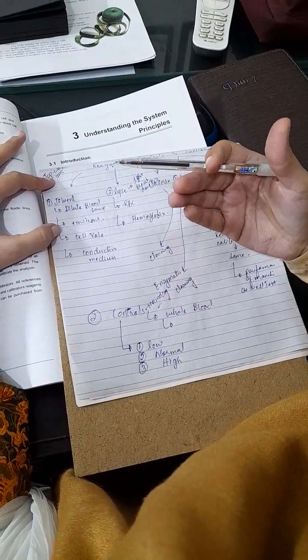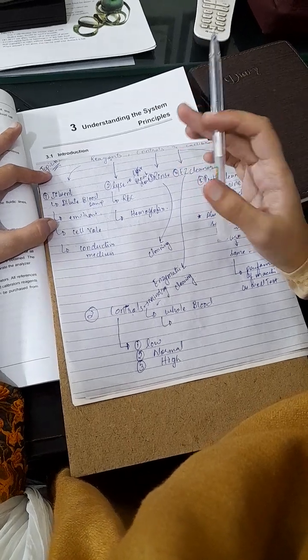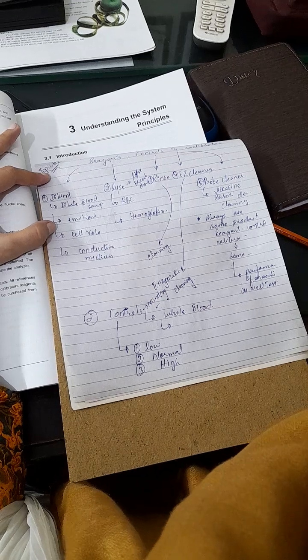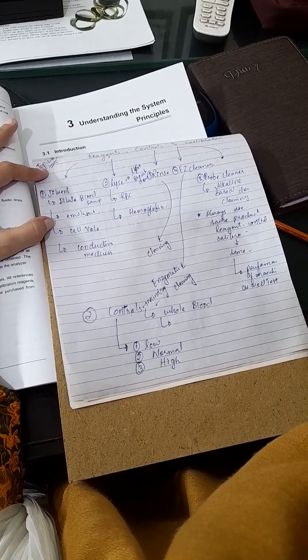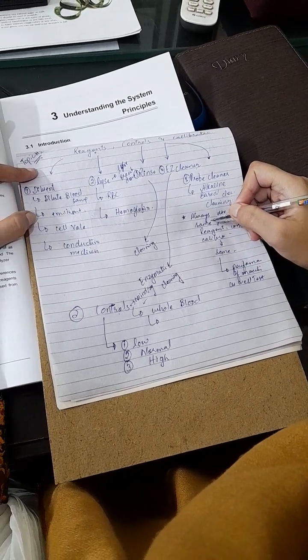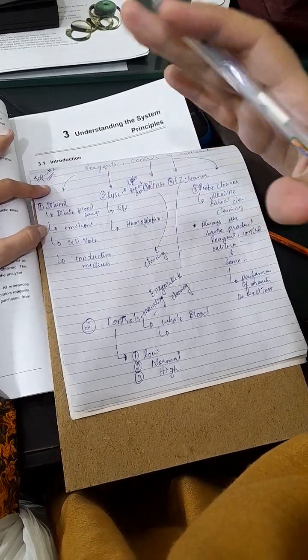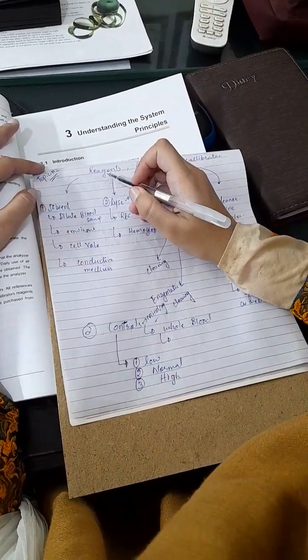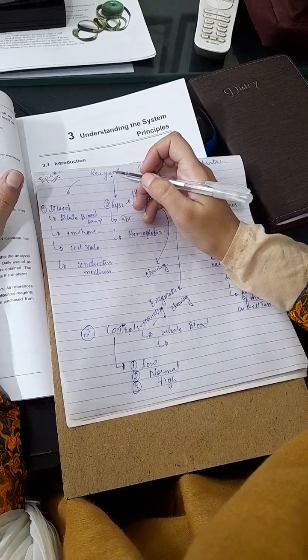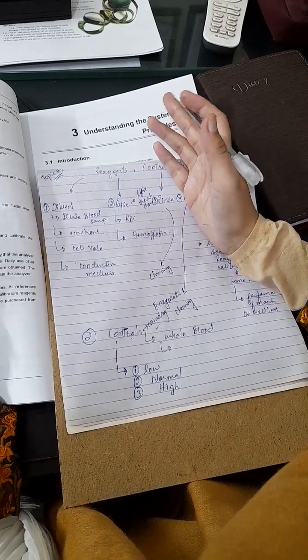It means we should use the Mindray reagents for better performance of our machines and better results of our samples. If we use reagents provided by a third party, it may lower your performance and there may be variation in the results. The reagents are very important to perform the test, because if you only have a machine and no reagents, you can't perform the test.